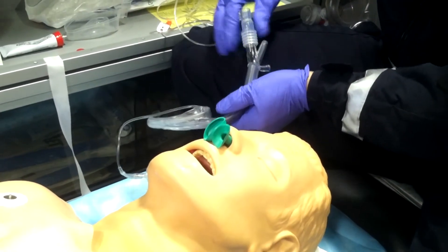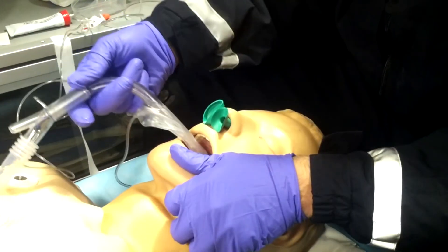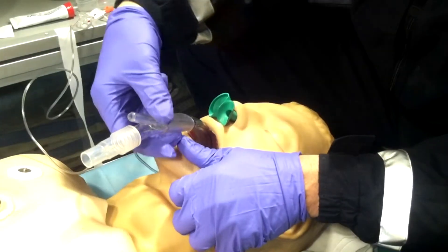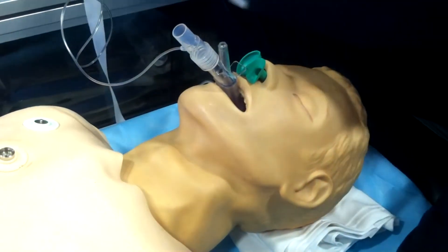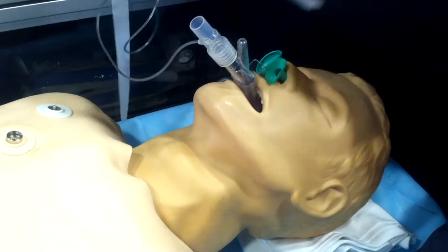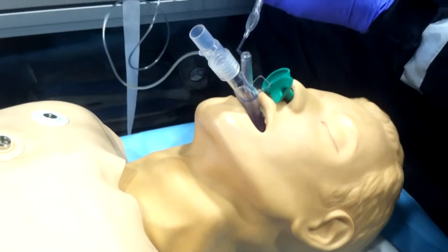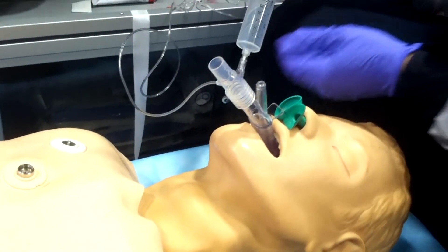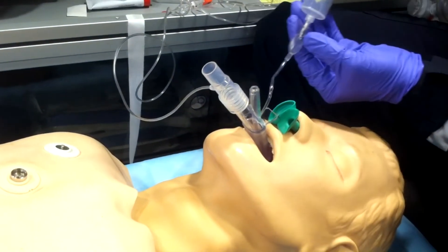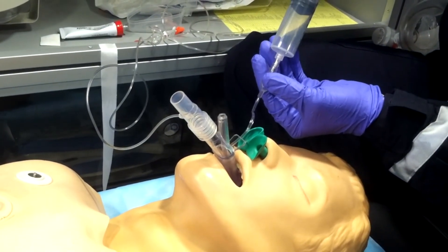For insertion, place it at the mandible — you don't have to stick your fingers in — and slide it against the hard palate, sliding it all the way in until you meet resistance. Once you meet resistance and it's fully seated, leave it there. Confirm it's properly placed: the fixation tab should be 1.5 to 2 centimeters above the upper lip.